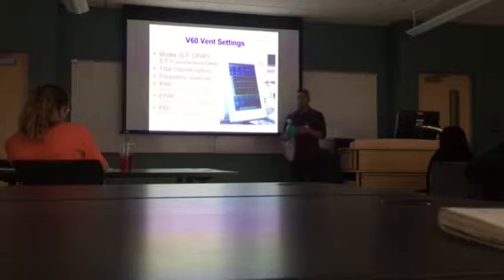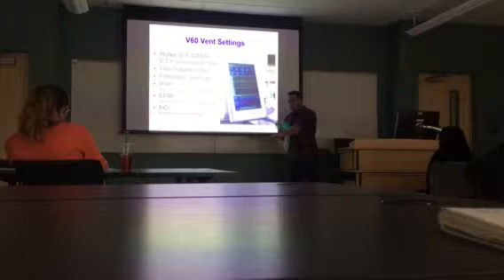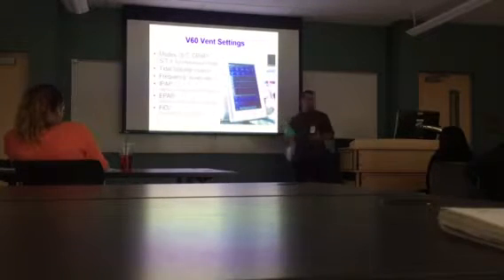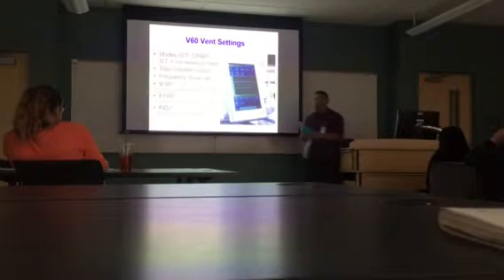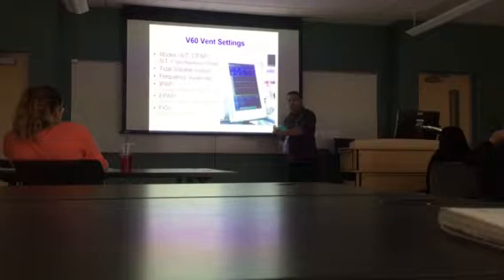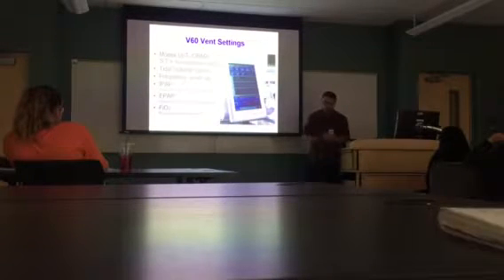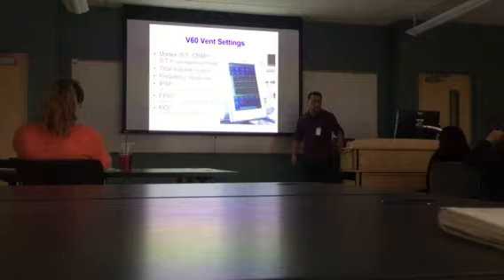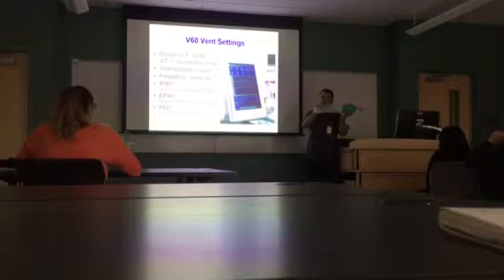With BiPAP in the ER, if a person had a hard time breathing, we would maybe give them a nebulizer treatment. We would put that nebulizer treatment here, then put the mask on the patient, and every time they wanted a breath, we'd give them a breath with their nebulizer, like this. But coordinating it was difficult because patients are breathing very fast and in distress, and when you put a mask on them they feel like you're trying to suffocate them, right? So they went from doing this, because it worked, to putting a patient on non-invasive ventilation with a mask. Same concept. There's the IPAP, and then the EPAP is part of it, and we'd be giving them 100% oxygen.